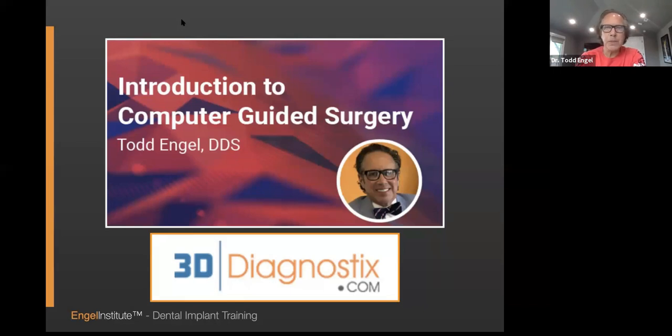A lot of what you're going to see is subjective. And what I mean by that is I tend to teach, well, I do teach very agnostically, which means that I'm going to teach you how to do guided surgery regardless of what implant you choose, what CBCT you have, what guided surgery kit, regardless. This is about how to do guided surgery.